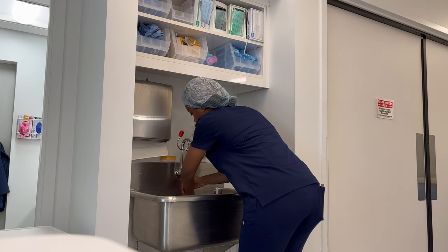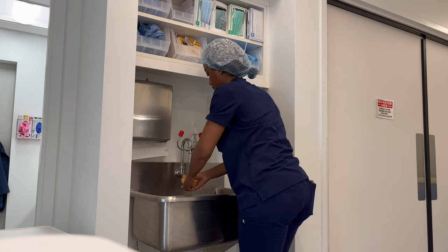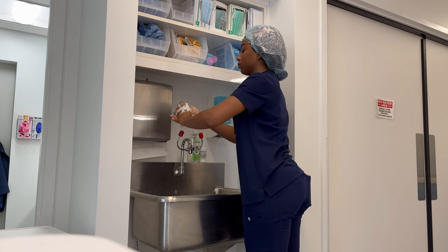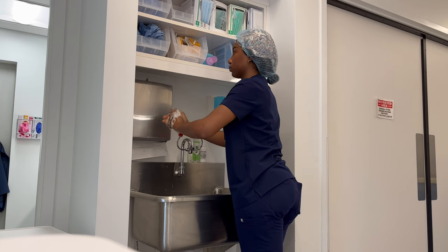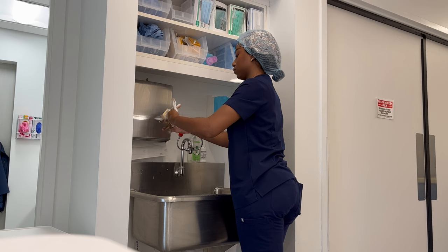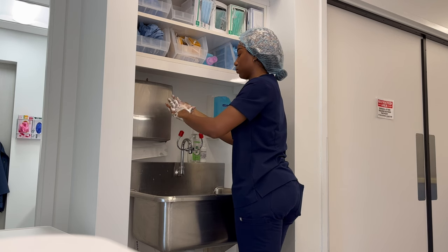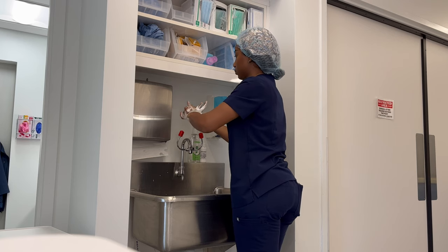I do have a scrubbing video where I go into detail about how to scrub. If you want to see that, I will link it in this video, right on top of the screen. I'll put a card. So I go ahead and do that, and I do the 30 second brush stroke count method that I use. There's different ways to do that. I think I talked about that in my other video, but I will link that so you guys can see how to scrub. But that's what I'm doing here.